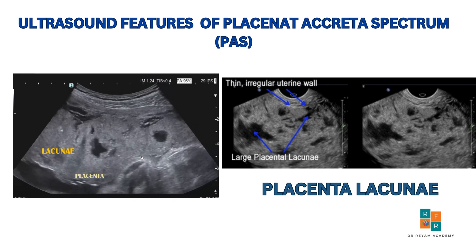There are several sonographic features that help diagnose placenta previa accreta. The first feature is placenta lacunae. Placenta lacunae appear as sonolucent, dark fluid-filled spaces within the placenta. They often give a moth-eaten appearance on ultrasound. These spaces are an important indicator of placenta accreta spectrum, especially when they are large, irregular, and show turbulent blood flow. Lacunae are more commonly associated with placenta accreta spectrum.